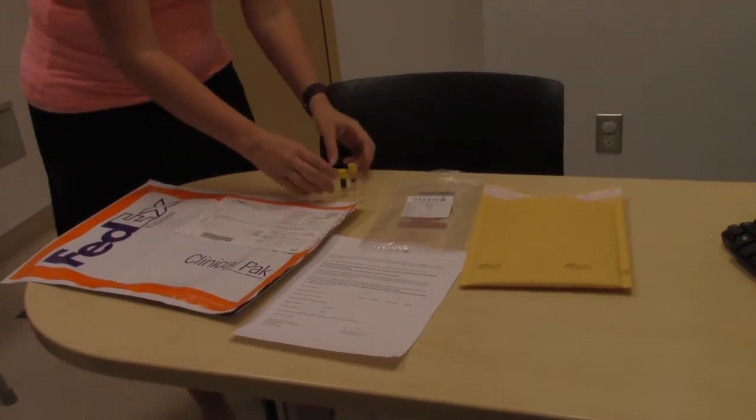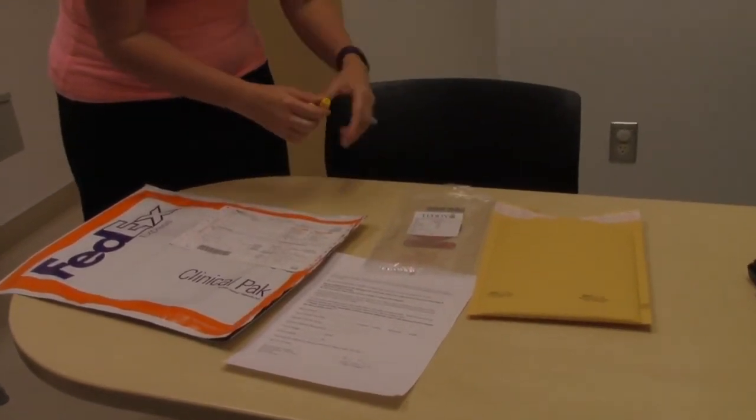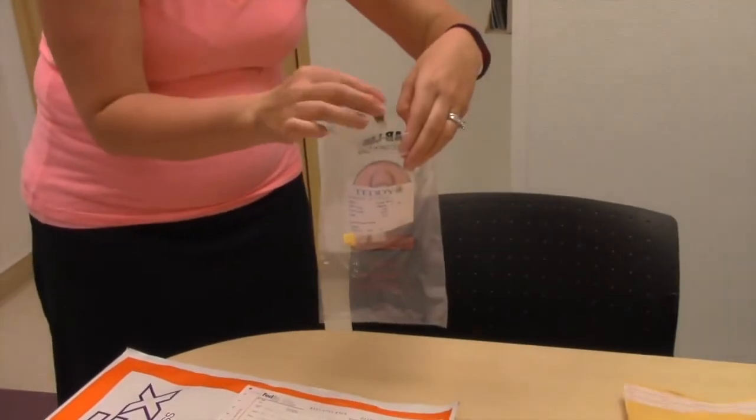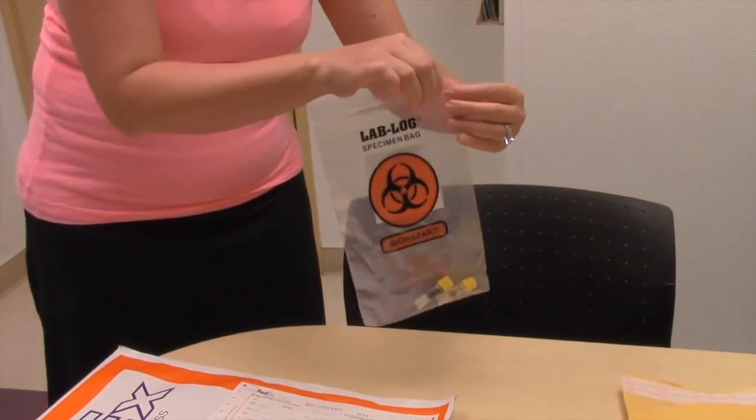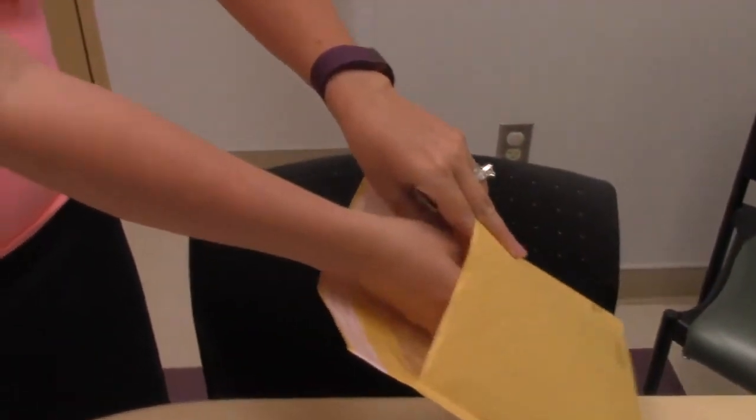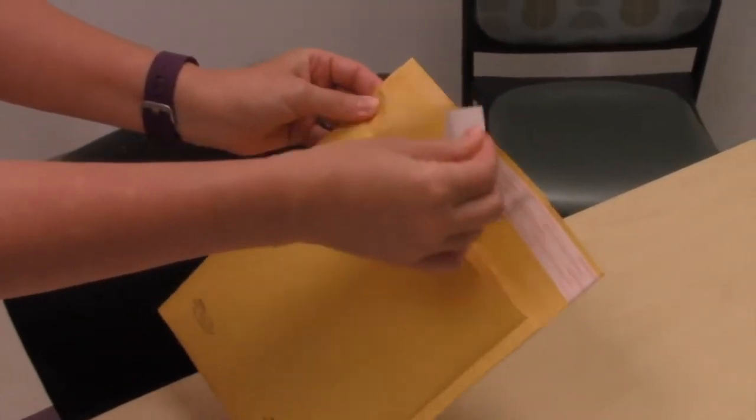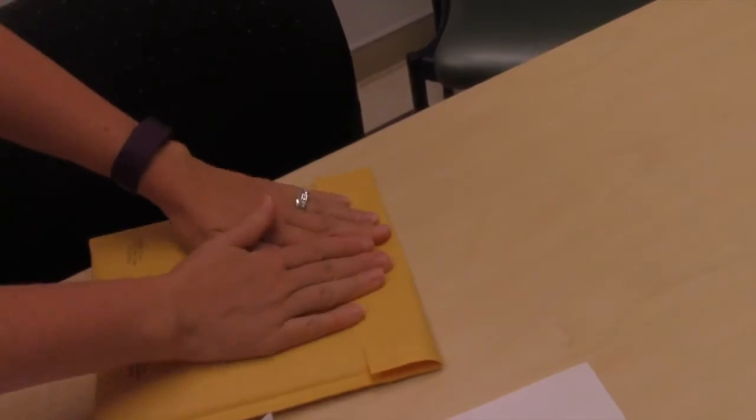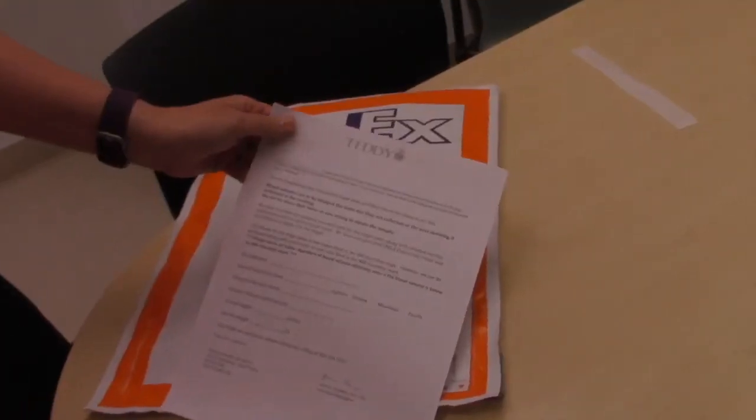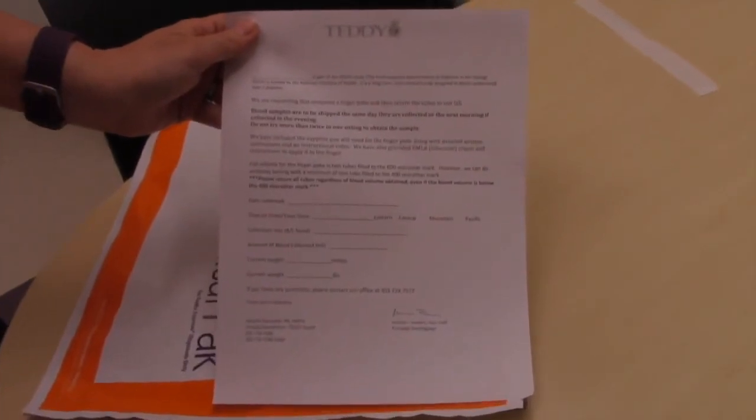Finally, make sure the tubes are capped tightly and put the tubes of blood in the biohazard Ziploc we have provided. Roll the Ziploc bag and place it in the padded envelope. Place the padded envelope in the large FedEx envelope. Please complete the blood collection form and place it in the large FedEx envelope as well.